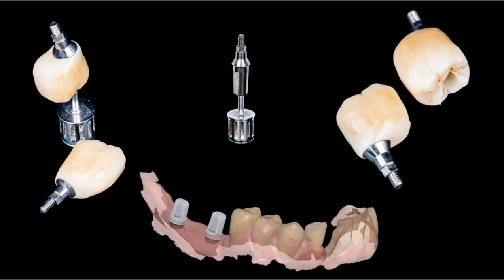In digital direct technique, deep subgingival margin can be easily captured thanks to the alignment of the extraoral abutment scan with the intraoral scan. Note here how the margins fit perfectly. In contrast to the direct conventional technique, in which subgingival margins of your abutment cannot be captured well, and so the marginal fit of your final crown will not be acceptable.